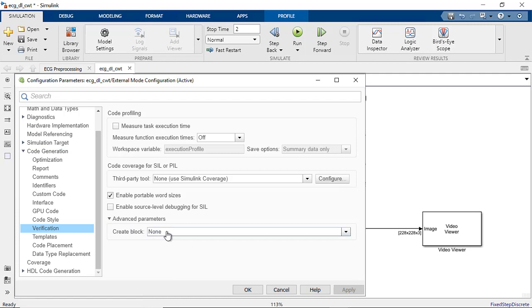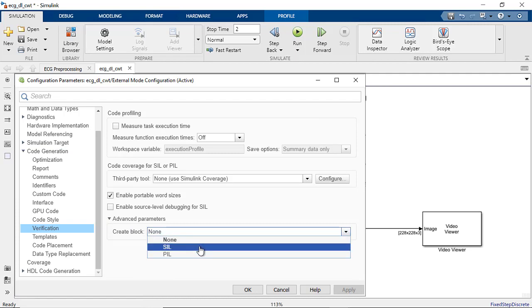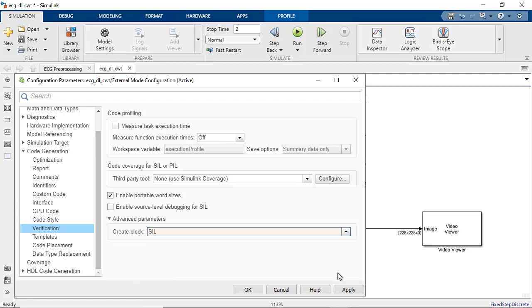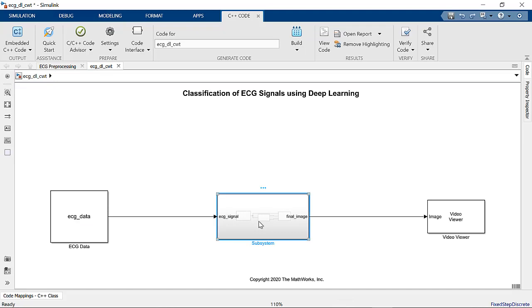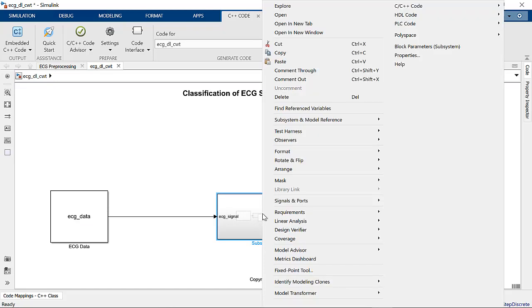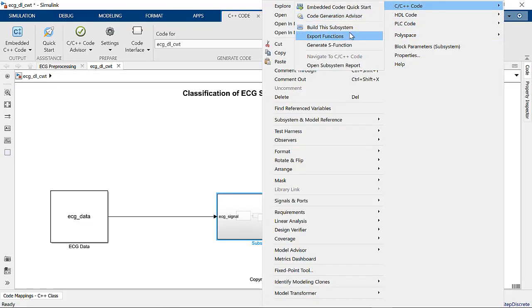Under Advanced Parameters, set the Create Block option to SIL. Let's go ahead and generate CUDA code for the subsystem that contains the pre-trained network.